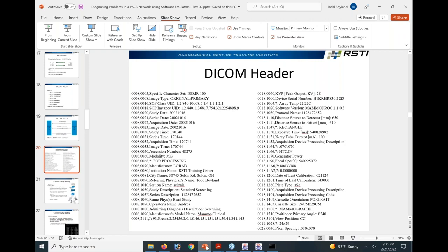And then look for the command, the tag 0,900. Does anybody see 0,900? In DICOM, that's the status field. So draw an arrow to 0,900. That's the status field. In DICOM, 4 zeros means success. So the status field of 0,900 should be 0,000 if it was successful.